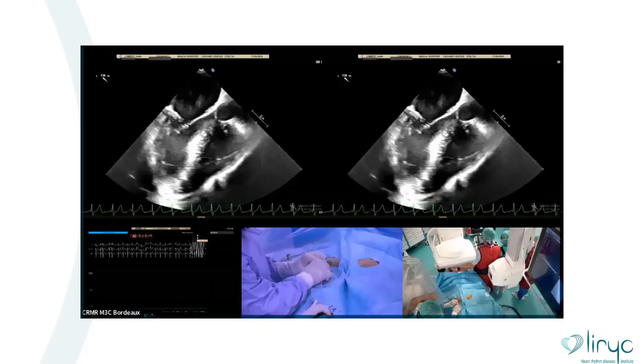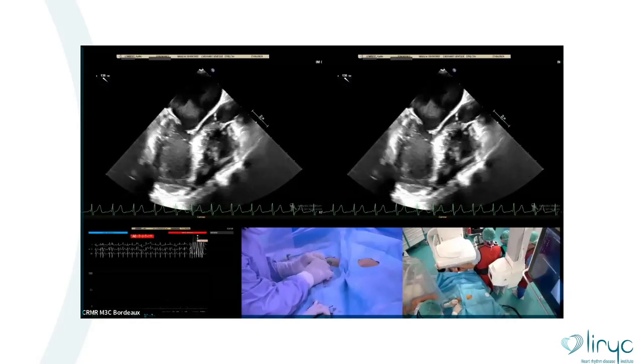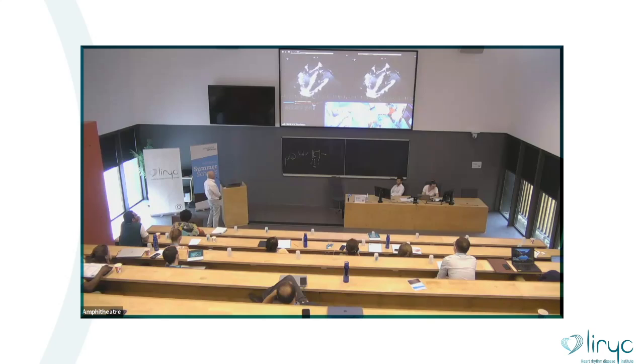Try to rotate. You are back already in the ascending aorta. Have you seen the curl of the catheter? I've always seen the shaft, but I've never seen so far the curl of the catheter. You have not demonstrated that the curl of the catheter is looking anterior, towards the VSD. As long as you're not sure of that, you can fish for a long time.